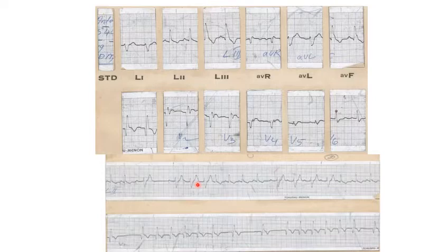Okay. Sir, intermittently we are seeing RBBB and LBBB pattern. Okay, very good. One more, and that's enough. This is another example: RBBB with intermittent left anterior fascicular block and left posterior fascicular block. This is RBBB with the intermittent left anterior fascicle and left posterior fascicle, indicating that three fascicles are involved.